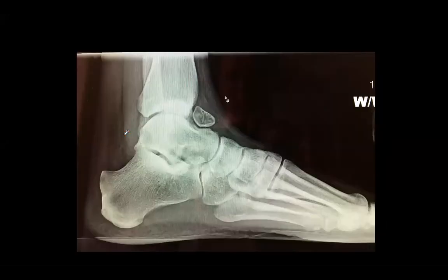All right, we have a pathology at the posterior calcaneus. I know some of the students last week I was talking about in clinic. What are the 2 angles we look at when we want to evaluate a Haglund's deformity? So bursal projection, which is actually more of a measurement, and the inclination angle of the calcaneus.